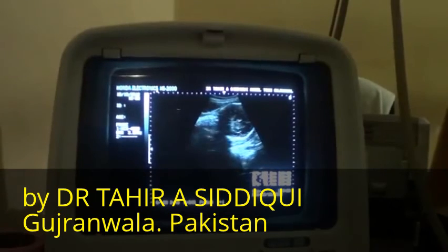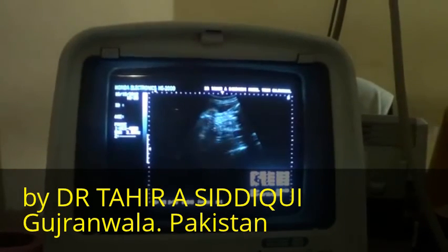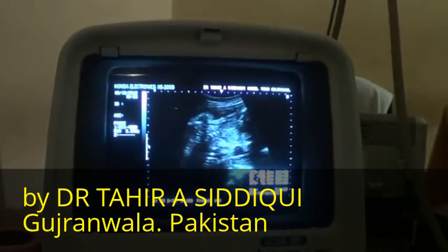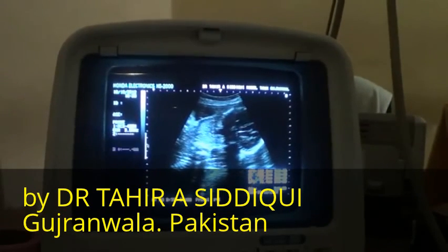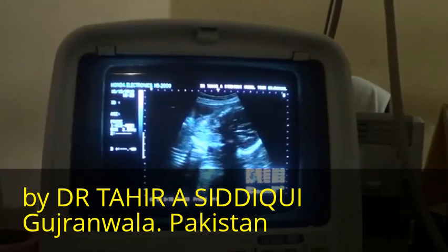This is the head. Again, a short review. The mass, the head, the bilobed mass, the chest.